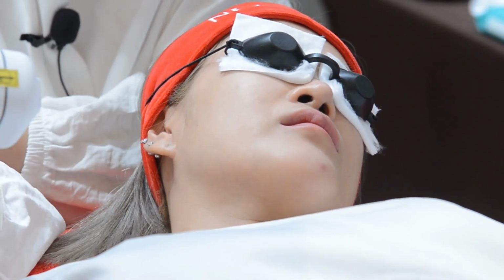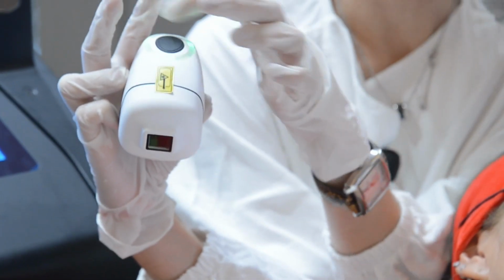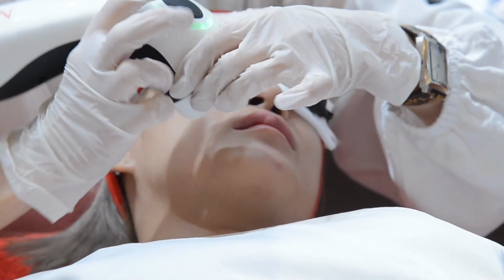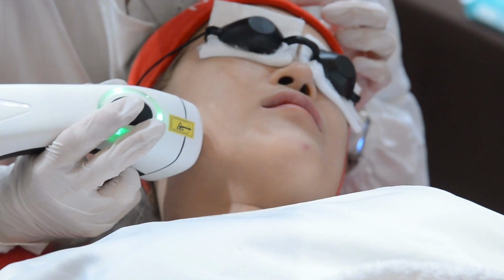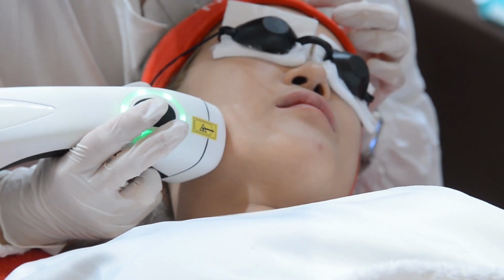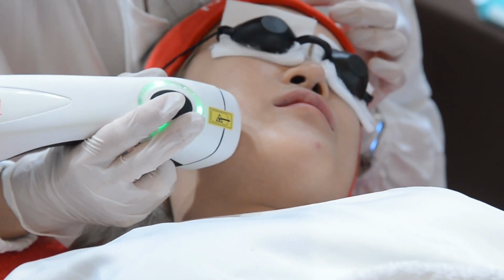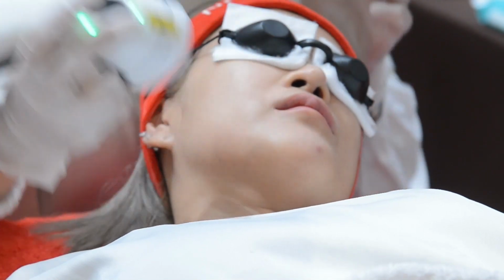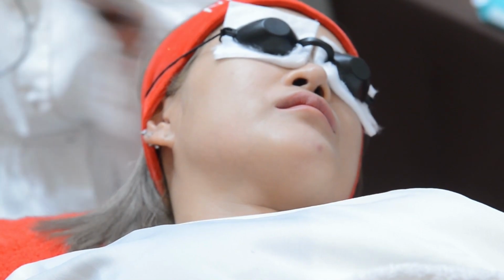So we have to wait until this hourglass goes off, then that's where you can start shooting, because right now it's still on, initializing. Okay, so with this, means it's ready. Start from here. Sorry, I'm supposed to wear my goggles. Forgot.